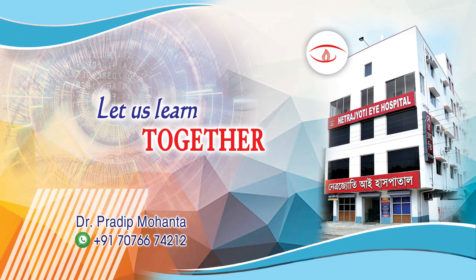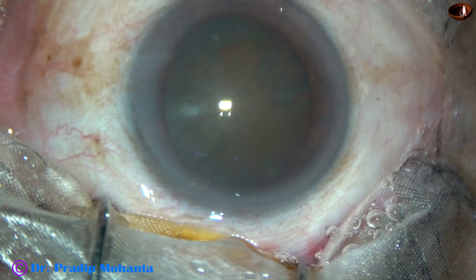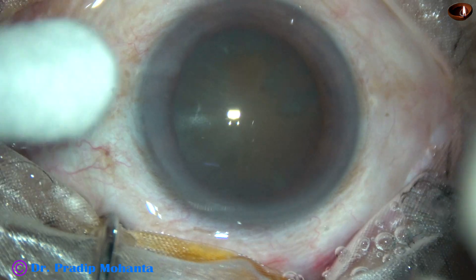Friends, welcome to my workplace at Ranaghat, West Bengal, India. This is a hard cataract with well-dilated pupil. Let us observe this surgery.